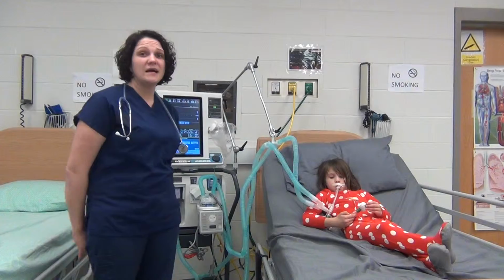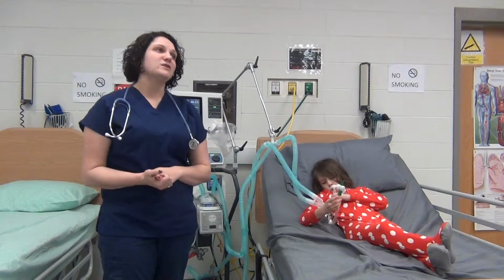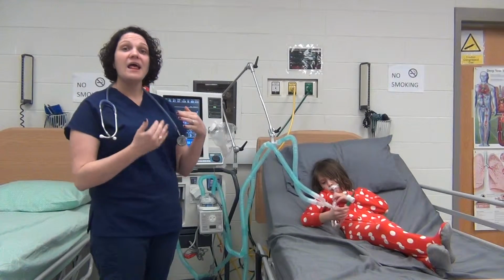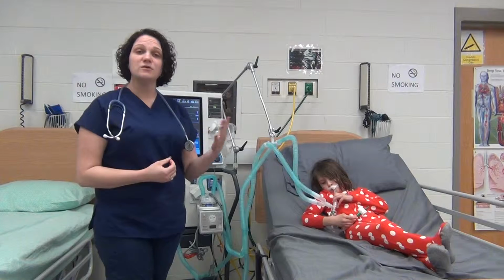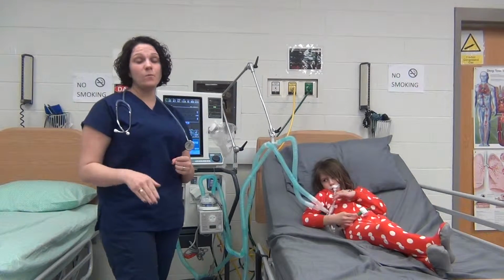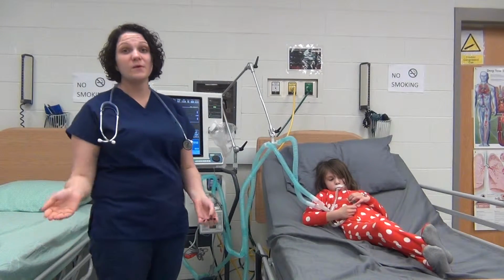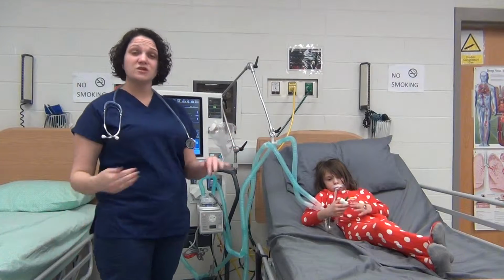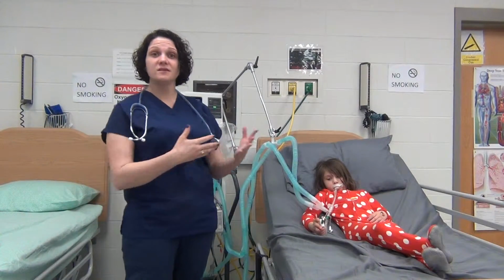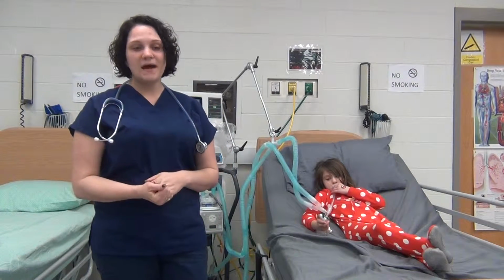I also want to make sure as I'm weaning her that I'm only weaning one thing at a time. If I'm going to change her rate, I change her rate and then take some time and wait to see how she reacts to that change. And then go in and wean her FiO2. So I want to make sure I do it one thing at a time because I don't want to change a whole bunch of things and then she starts going downhill and I don't know which thing I changed caused the problem. So I want to make sure I wean her one step at a time.